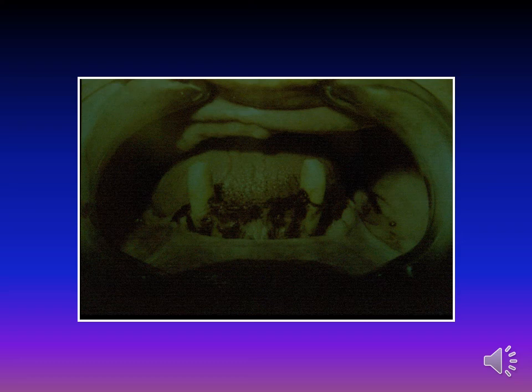which is root reduced and under the level of the alveolar crest by 2 millimeters. We do the filling first and then reduction after endodontic treatment. This is one of the techniques, and we submerge the root under the soft tissue and below the crest level by 2 millimeters.